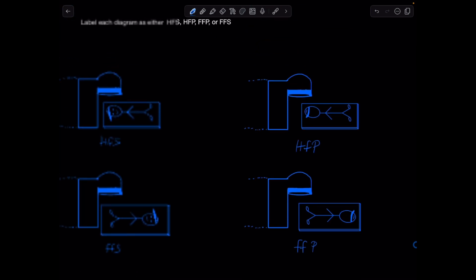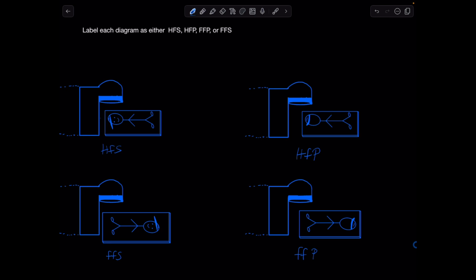So these positions are relatively straightforward, but you might have trouble knowing your left or right from the patient's left or right. So to know your own left or right, if you struggle with that, hold up both of your hands and try to make the letter L. The one with the correct orientation is going to be your left hand, so that is your left. The patient's left is either going to mirror you or it's going to be the same as yours.